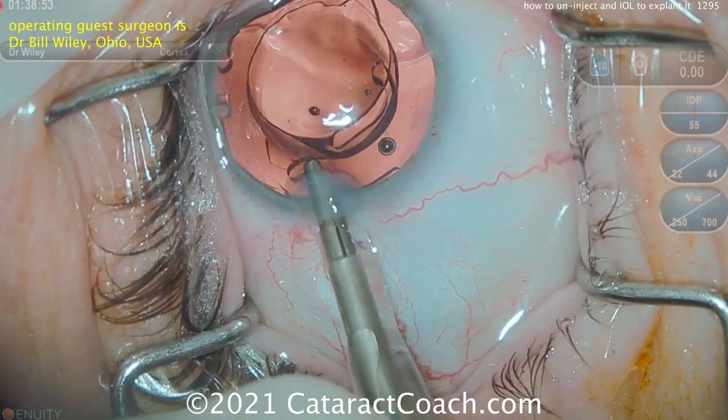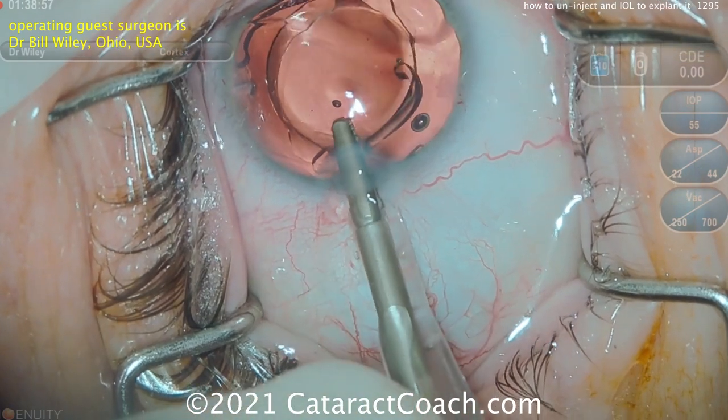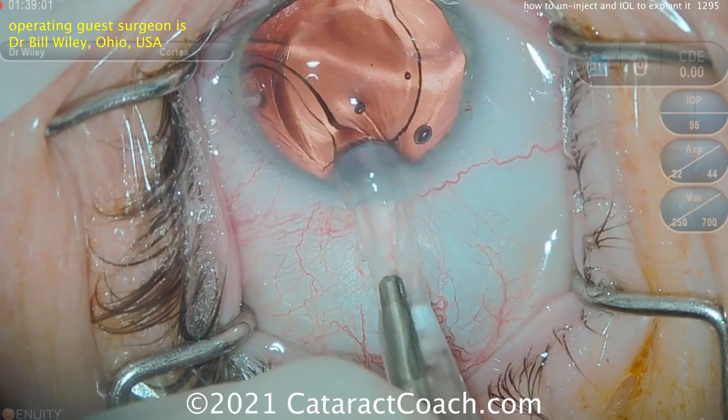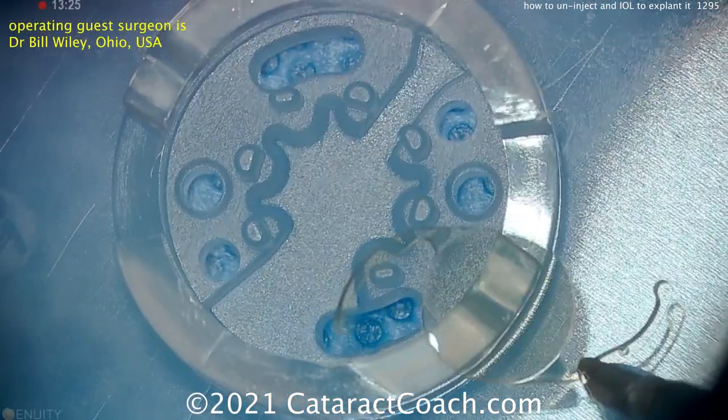Again: the cartridge is held up against the incision, the forceps go down the barrel of the cartridge, grab the IOL, and just retract it. These hydrophobic acrylic lenses come out pretty easily.